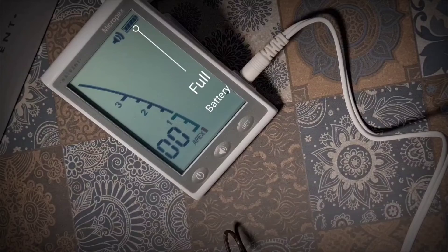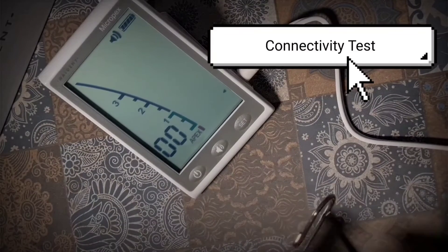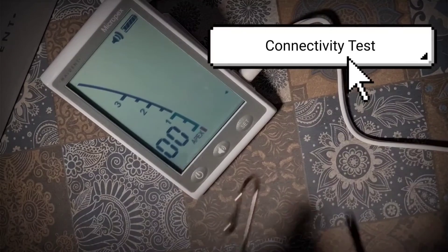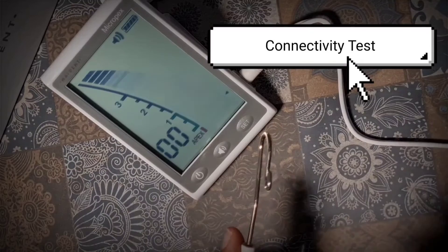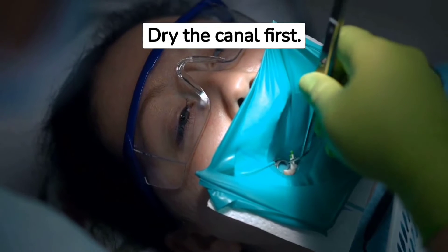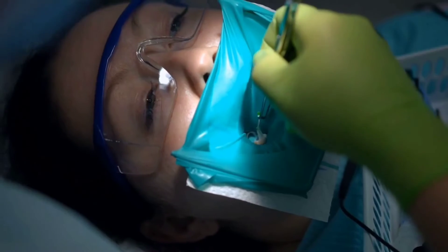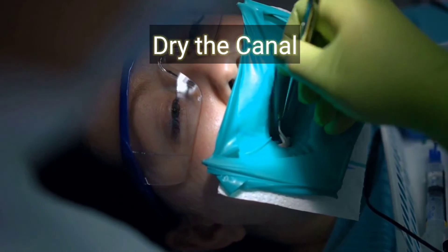The first tip is to make sure the battery is full. When you touch the file holder to the lip clip before the procedure, you can hear a beep — that means the cord is working. If the apex locator doesn't work, the cord may not be working, so check for areas of tarnish and clean them. If the file keeps beeping continuously when introduced, there may be too much liquid in the canal — either hypochlorite or EDTA — so dry the canal first.